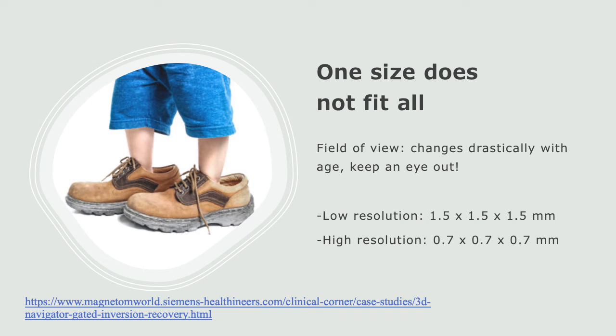We came to the conclusion that we would need two types of resolution for 3D cardiac imaging. First of all, for a low resolution, 1.5 millimetres would be used, and for a higher one, 0.7 millimetres. And it was agreed that the high resolution at 0.7 millimetres would be used with contrast, as this is something that we use for 3D cardiac printing. And unfortunately, when it comes to cardiac imaging, one size does not fit all, and the field of view would change quite drastically. So when conducting these 3D images, we need to make sure that the field of view is appropriate for the size of the patient.